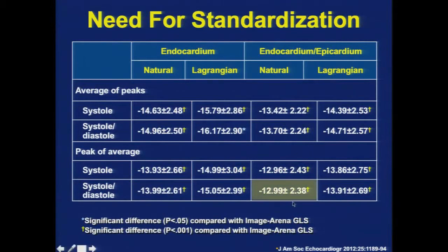We found that one vendor, Echo Insight, initially was looking at somewhere between the endocardium and epicardial strain, where the other was only looking at the endocardium. So if we just looked at endocardial strain, the values went from 12.9 to 13.99. One vendor was looking at a natural strain algorithm and the other a Lagrangian strain algorithm. They're different. It's beyond the scope of this discussion. But if we just corrected for that, now we were looking at only endocardium. Lagrangian strain went from 12.9 to 15.